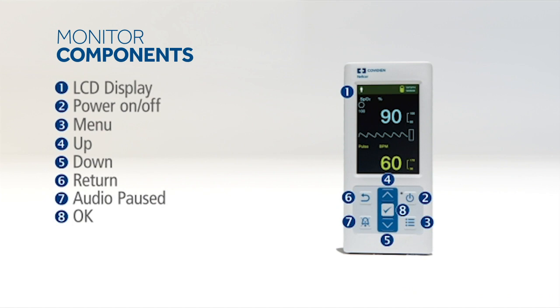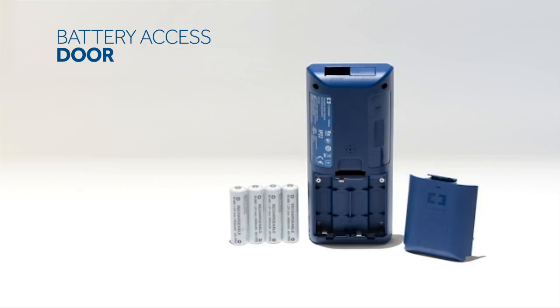The front panel is ergonomically designed with easy touch buttons to navigate the monitor. The power button is on the top right of the panel beneath the display — simply press and hold to turn the monitor on or off. The battery access door is on the back of the monitor, and the monitor uses four AA batteries.